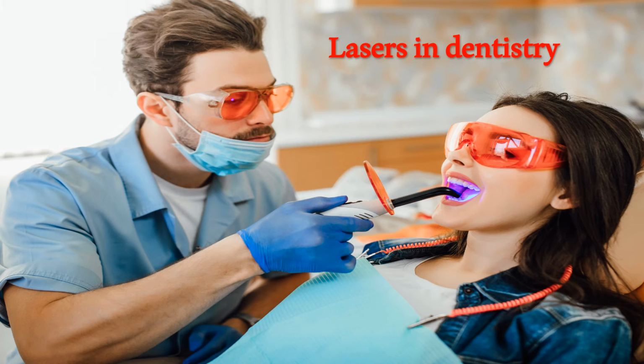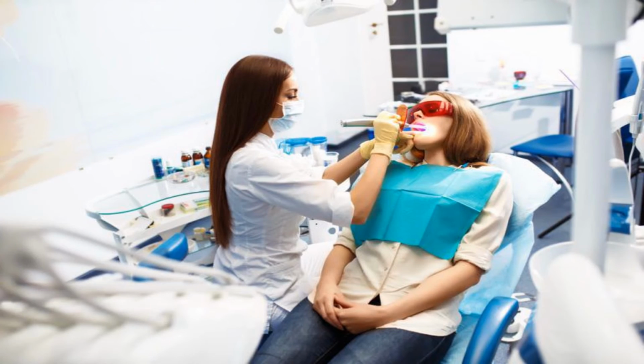Lasers can be used in every field of dentistry. Diode laser offers a lower cost area of digital dentistry to adopt, and it is very easy to use. It is used in periodontics, endodontics, surgery, and prosthodontics.